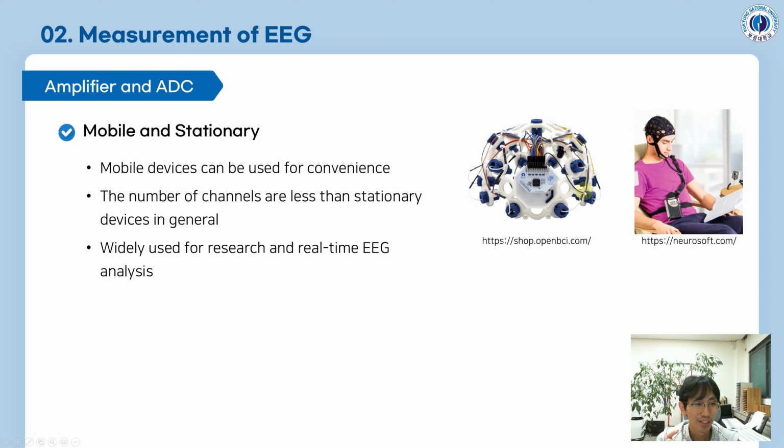As you see, this is open, and this is not well maintained on the outside, but this is working well, and many research papers are using this device as well. So yeah, I like this one. And Neurosoft, this is good as well, but I never used it before yet.